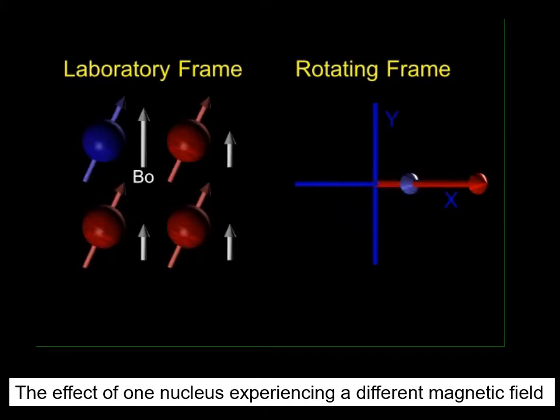This often happens when one has hydrogen nuclei that are in fat and hydrogen nuclei that are in water in the same voxel, because they precess at slightly different rates. So over various cycles in the MR imaging process, they will be in phase and out of phase with respect to one another.